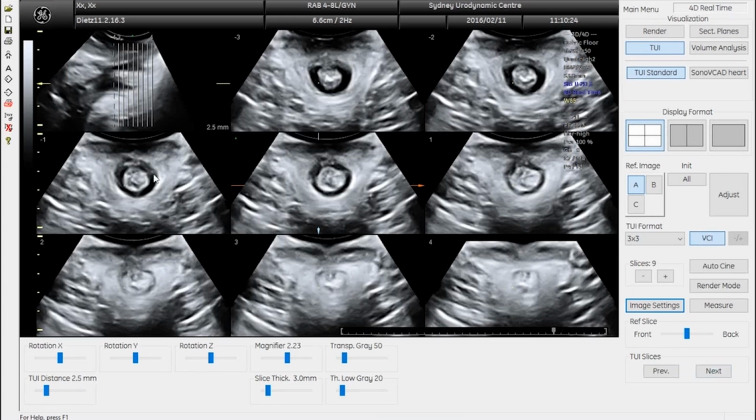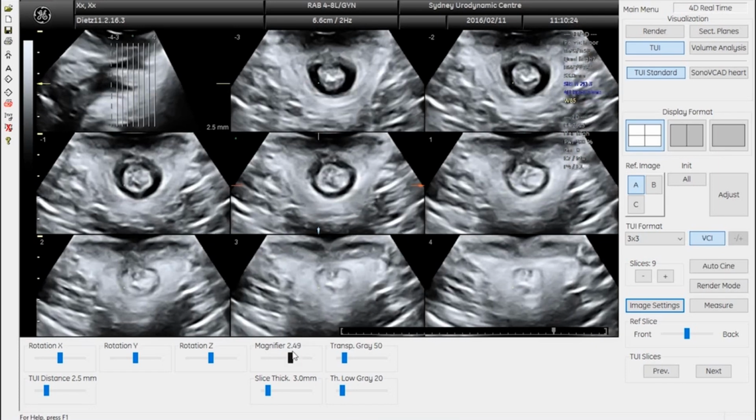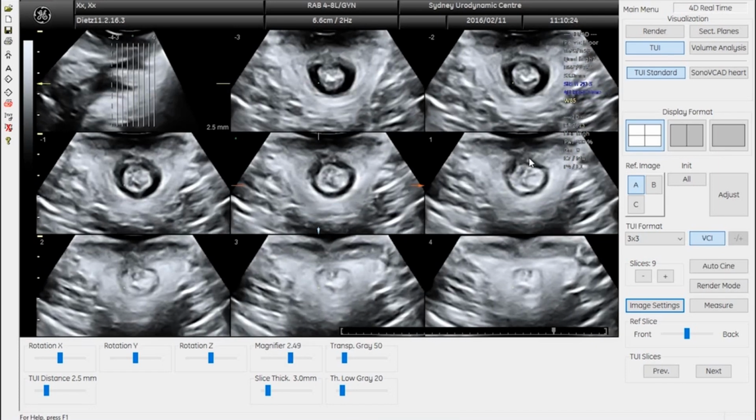You can see quite a bit of irregularity in the internal sphincter, and this is the main reason for me showing this volume, because that's suture material. So somebody had an internal sphincter successfully reunited here. You can see that. That's all the suture material all the way through, and you kind of lose it here. Not sure whether that was such a successful approach here.